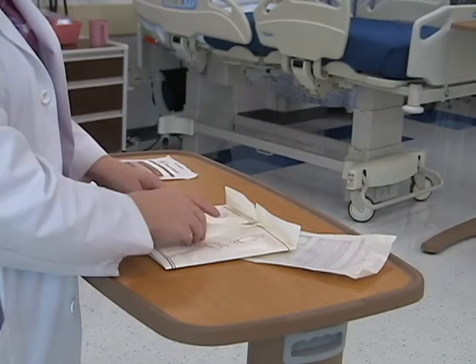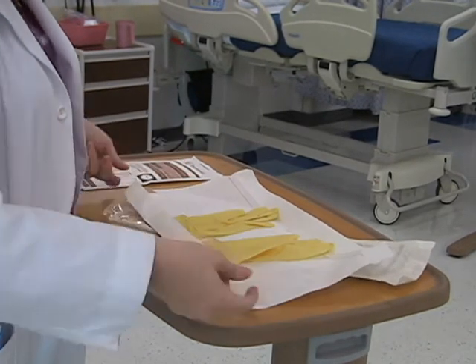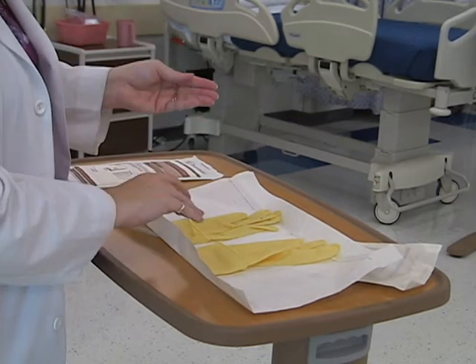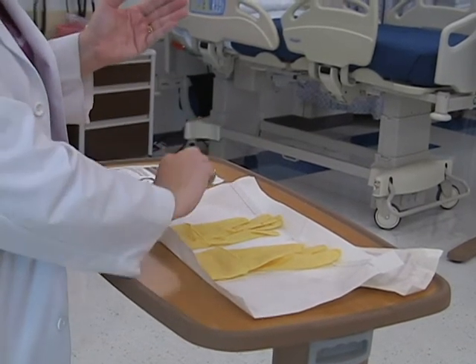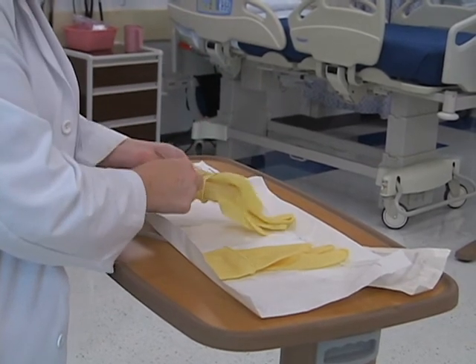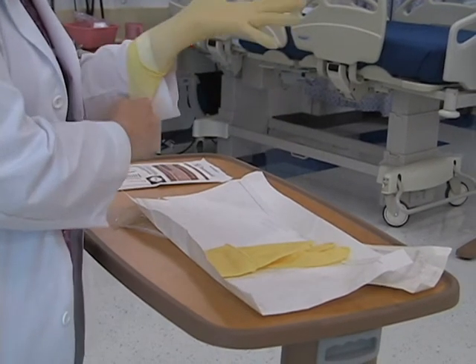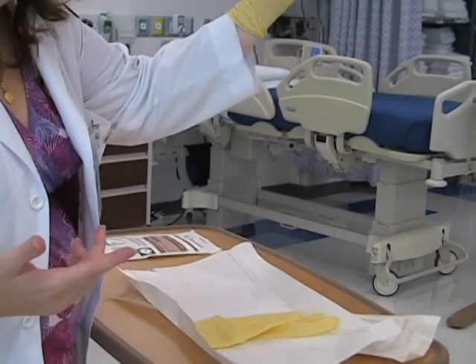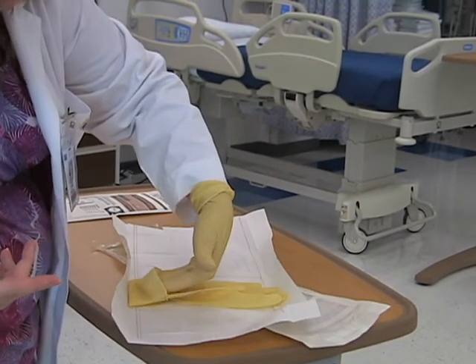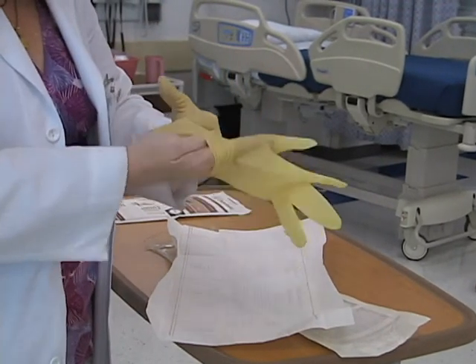So we're going to open it up. As you can see: left, right. Pull it open. And again, using your non-dominant hand, you grab inside the cuff and slide it on to your dominant hand, pulling the cuff down. Using your sterile hand now, you're going to reach inside the cuff — not touching the outside — and slide your hand up.